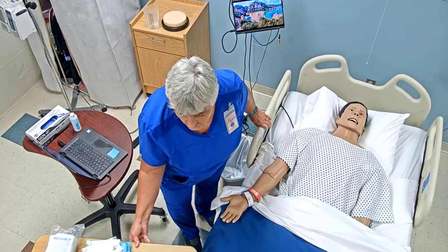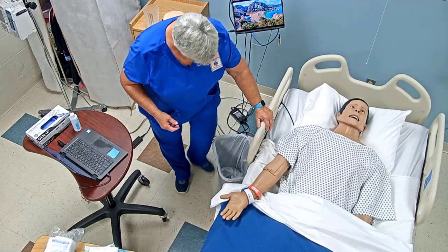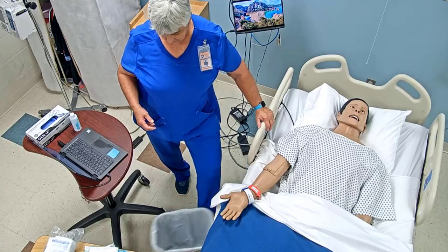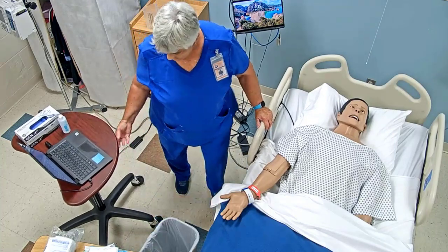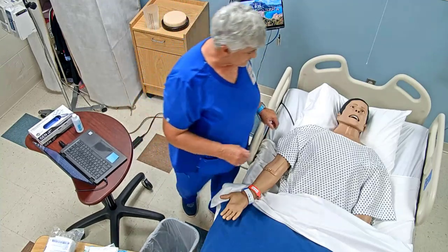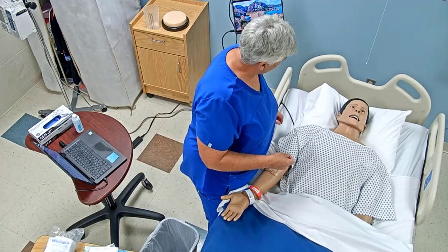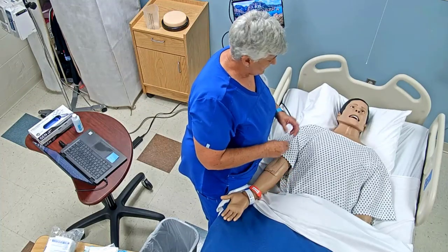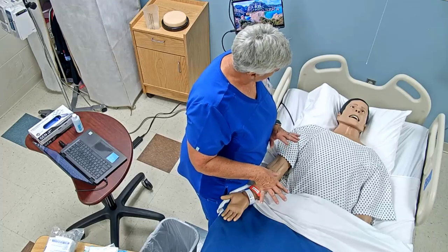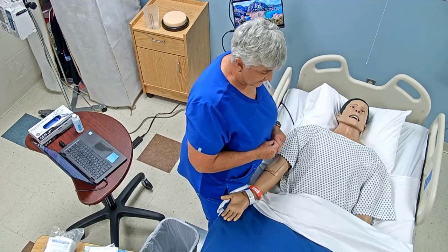So I'm going to put the bed at a good working height. I want to make sure that I provide for privacy. Let me get my trash down here. The doctor has ordered us to put a straight cath into your bladder. So we're going to do some care down in the perineal area, and then I'm going to put a catheter in there.